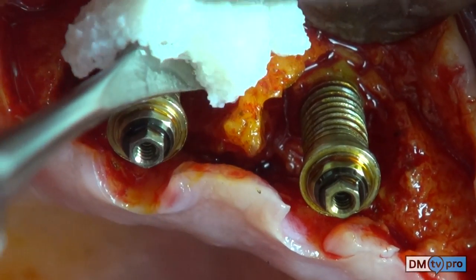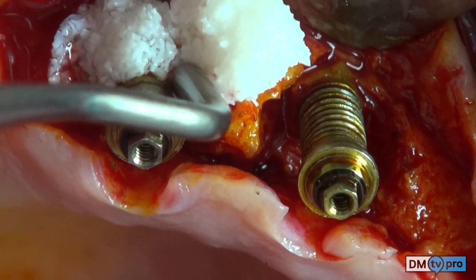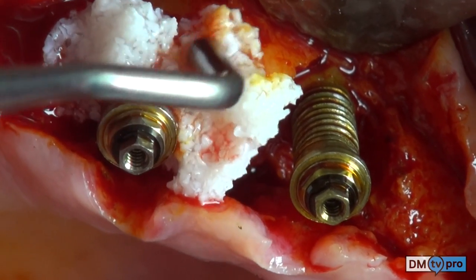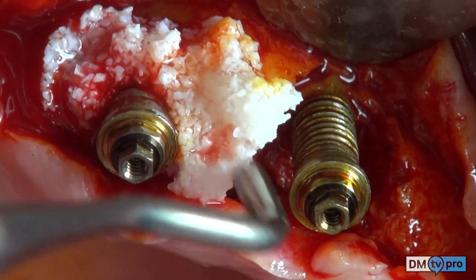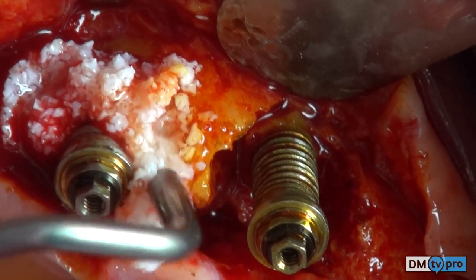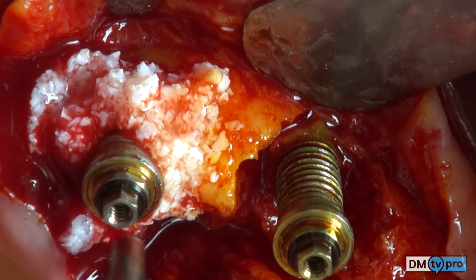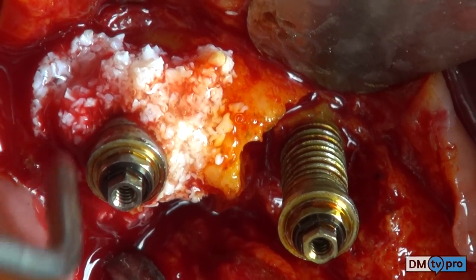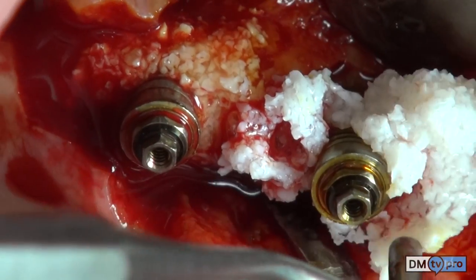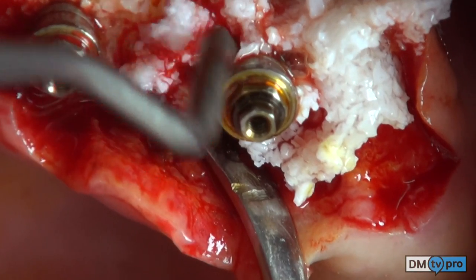The deproteinized bovine bone with fibrin sealant is used to fill the intrabony defects. The mixture of biomaterial and sealant is packed with an amalgam condenser with gentle pressure in order to allow better penetration of blood, and during the setting time of the sealant, a stable clot will form.